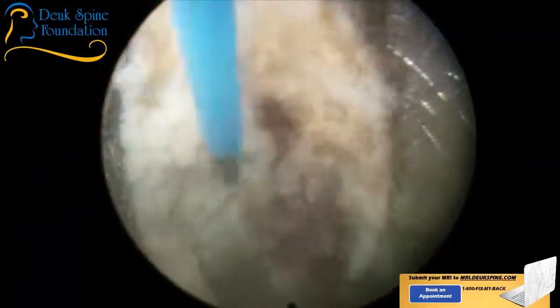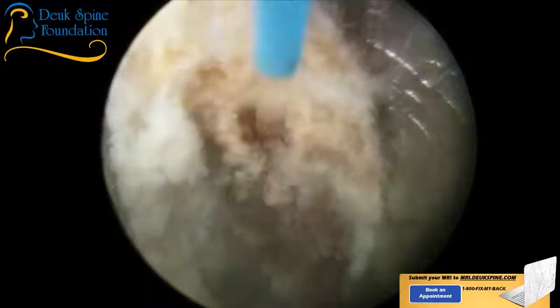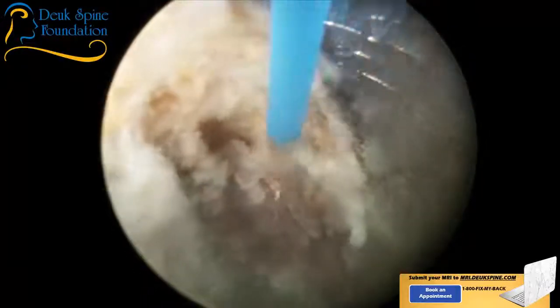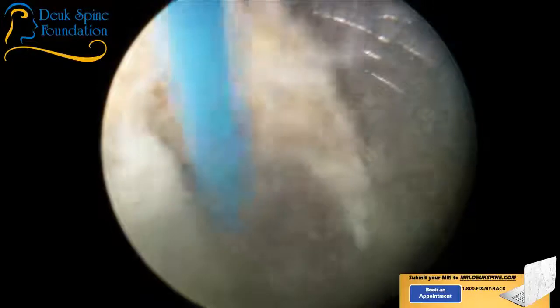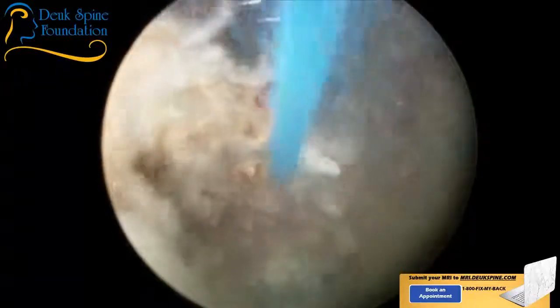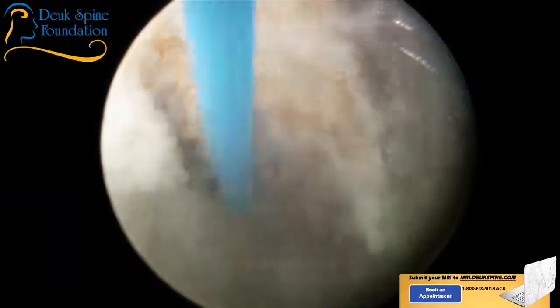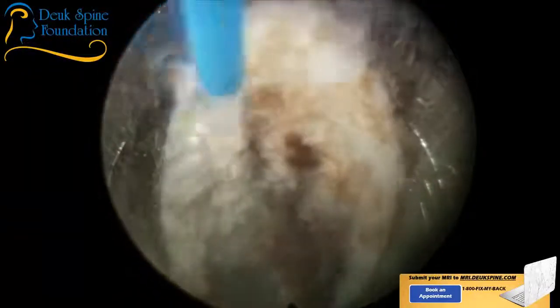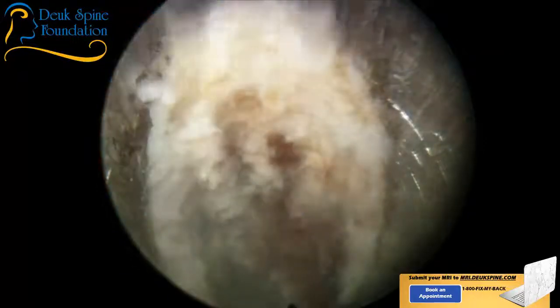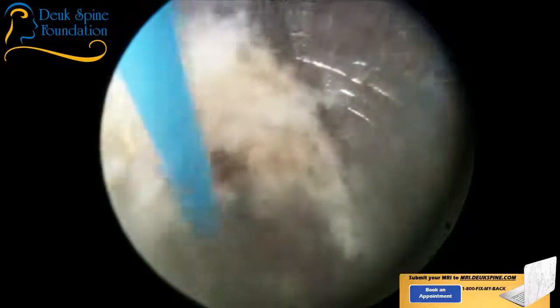Look at all this brown stuff. I've never seen so much. This is all probably hemosiderin. That's typically what would stain this color, hemosiderin, from a hemorrhage. And she said she's had pain since then in her whole back. Wow. I don't see a lot of hemorrhaging into a disc. It's pretty unusual, but it takes a tremendous amount of force and trauma to do that.